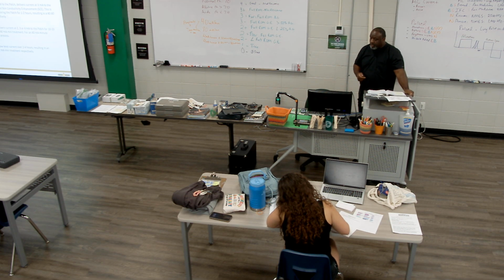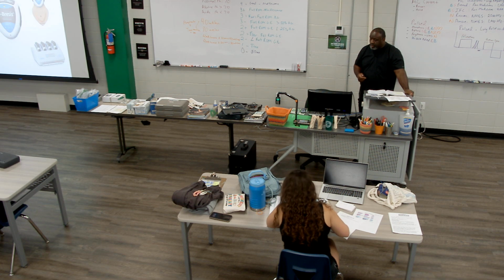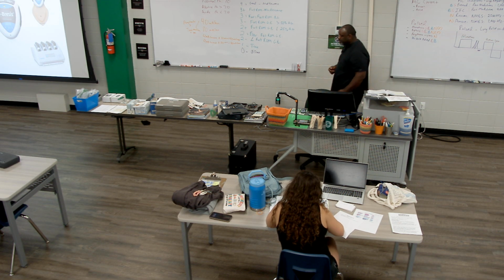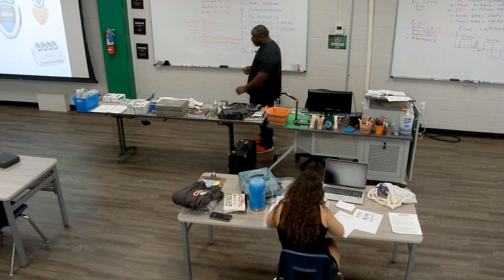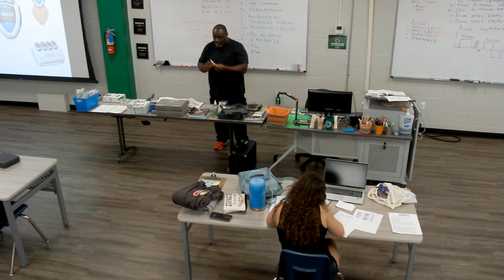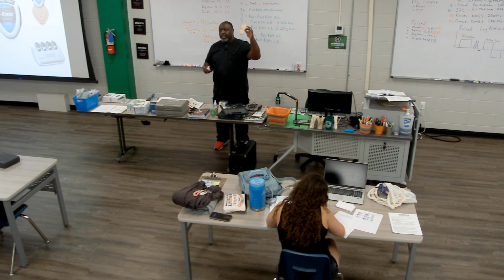All right. Then the last couple of things we'll talk about is this Iontophoresis system. This part here is called the electrode. So this is the electrode here. This is the controller.